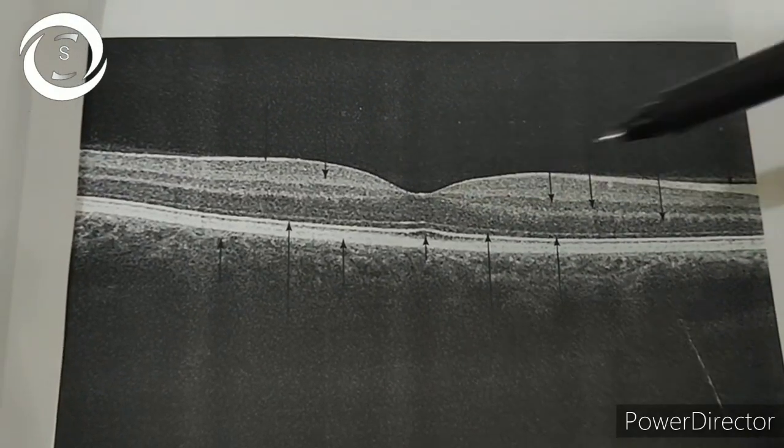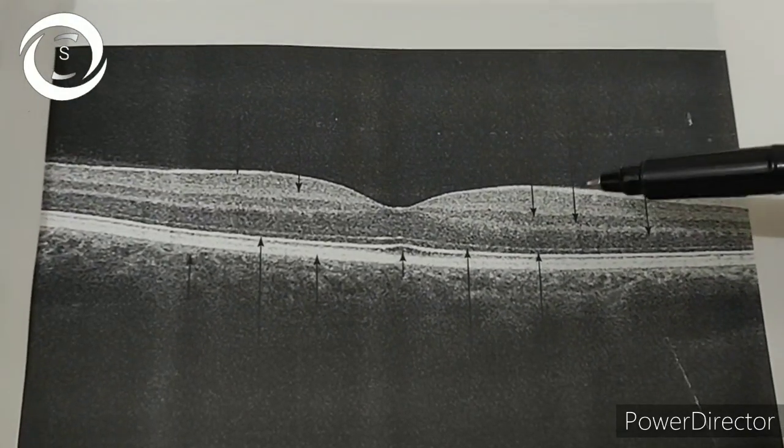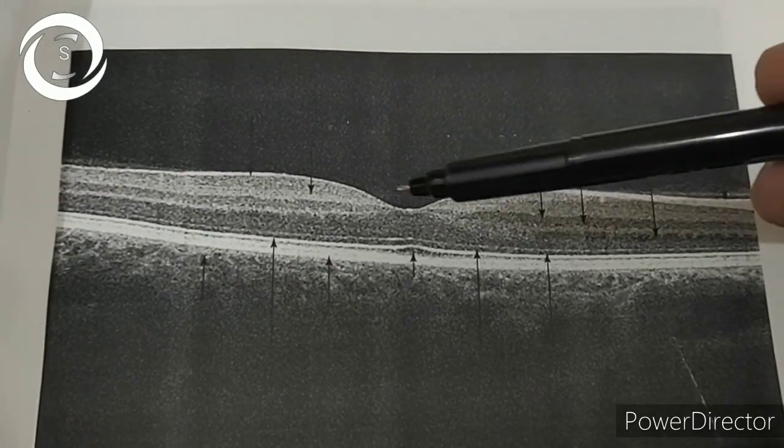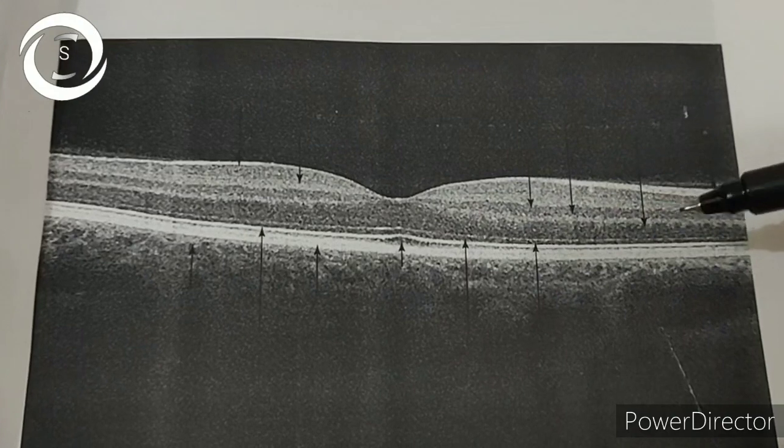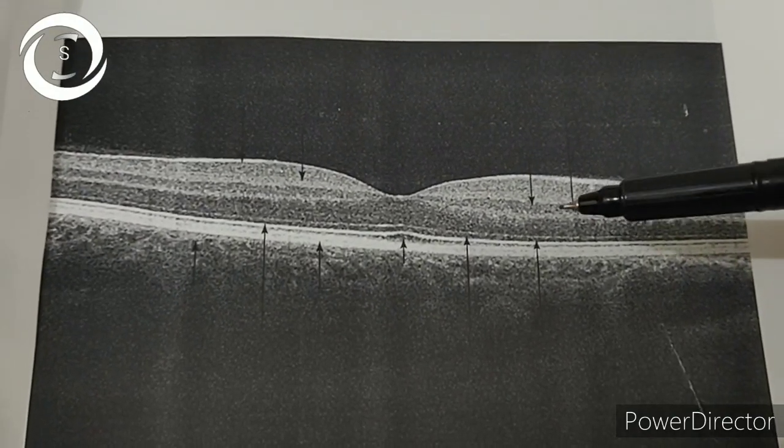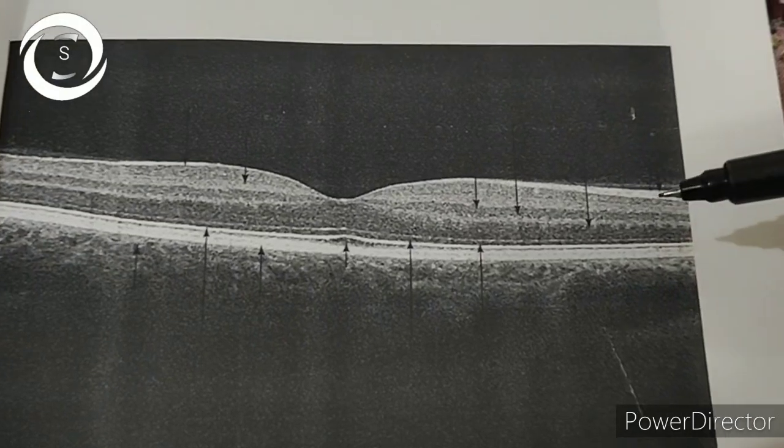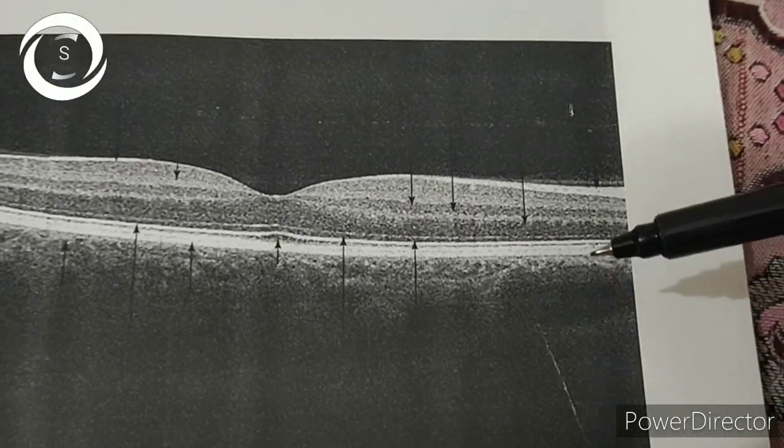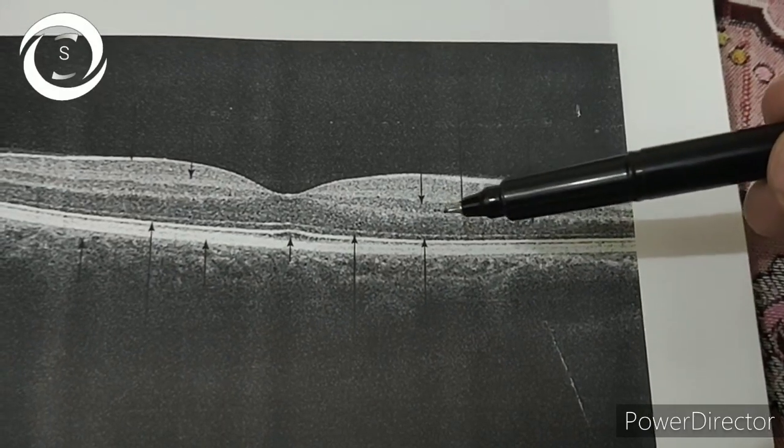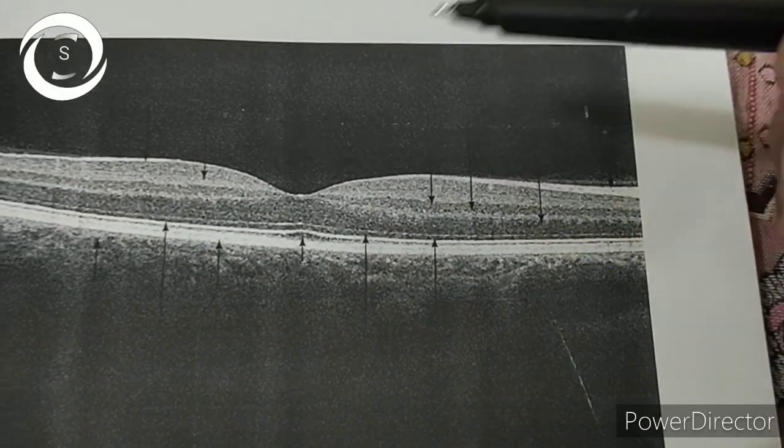Now this is an OCT of the macula. Look at which side the nerve fiber layer beneath the internal limiting membrane is thicker. Like here, clearly on the right side the nerve fiber layer is thicker, so that's the OCT of the right eye because the disc is on that side.